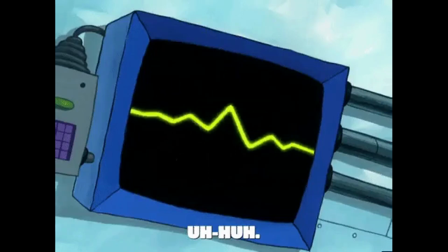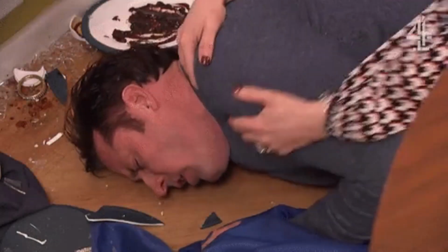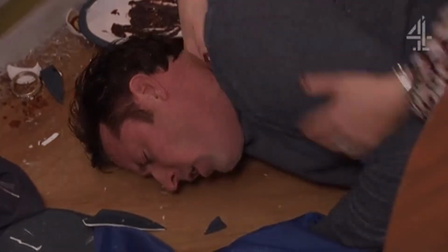1. Confirm cardiac arrest. If you see a person who appears to have an emergency episode, you need to check to ensure that it is cardiac arrest before you use an automated external defibrillator. Check to see if the victim is unable to respond, if they are breathing, and their pulse. You can use the ABC method. If you find no pulse or breath, you need to start CPR.